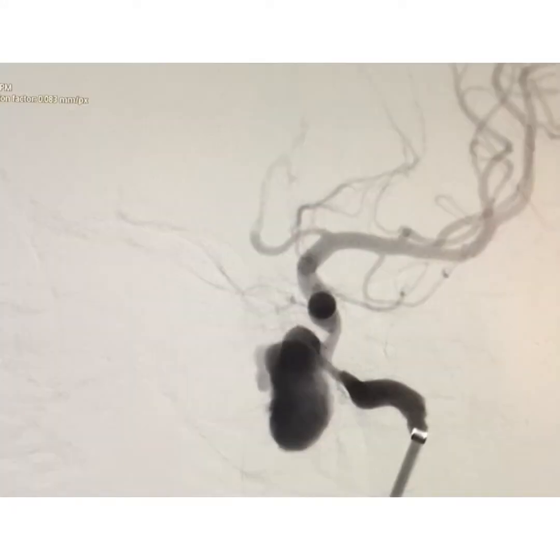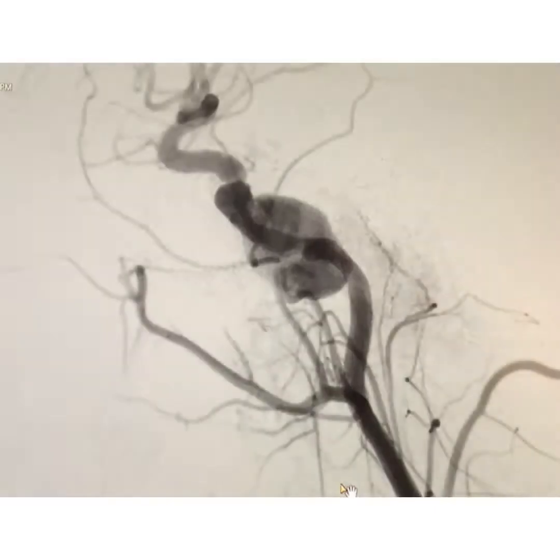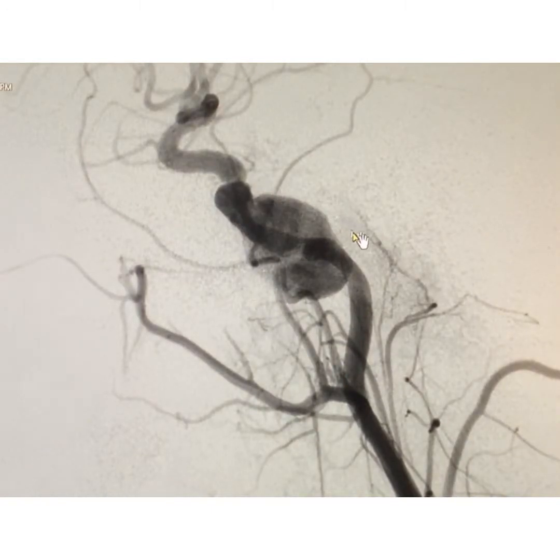For further management of the patient, he was referred to us, and we did an angiogram. This is the angiogram of the left internal carotid artery, which is showing there is a large aneurysm. So we can see this aneurysm over here, and this is a cavernous ICA aneurysm.